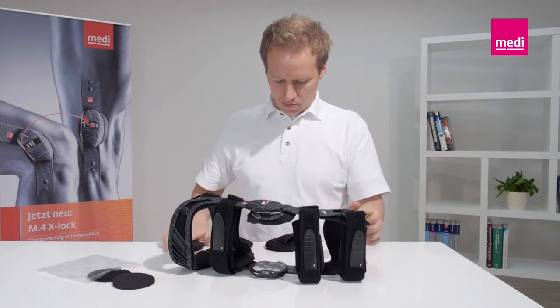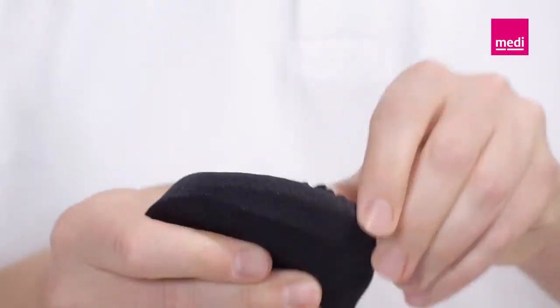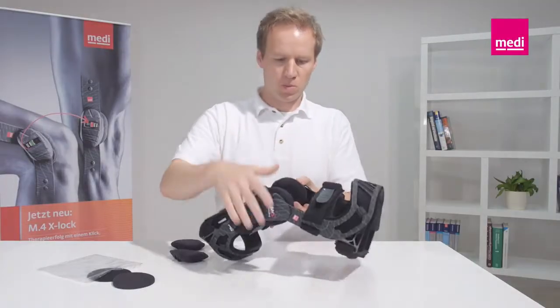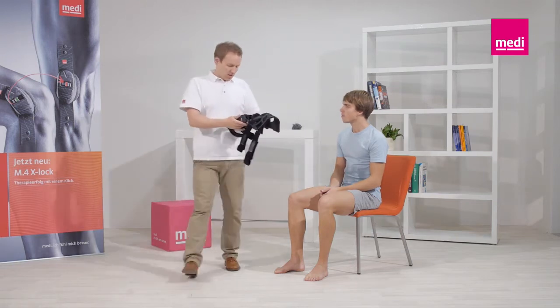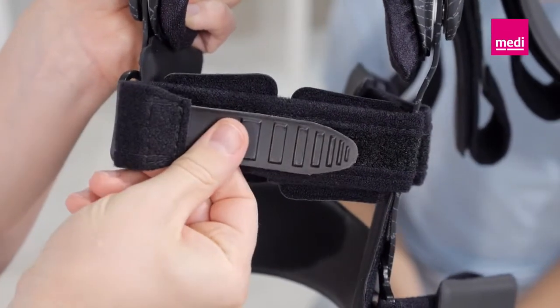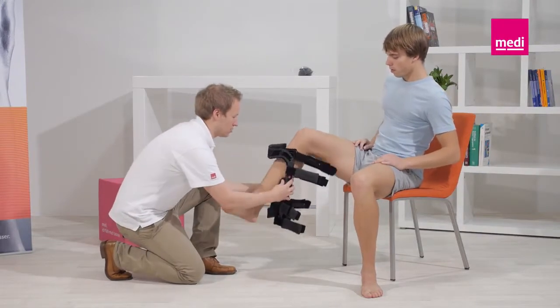Replaceable pads can also be used on the medial sides. This guarantees that the orthosis fits perfectly even on very thin knees or when swelling varies. The orthosis should be worn directly next to the skin to ensure the best possible fit. Make sure that all the straps are open. To prevent incorrect fastening of the Velcro straps, it's recommended to close them again afterwards.